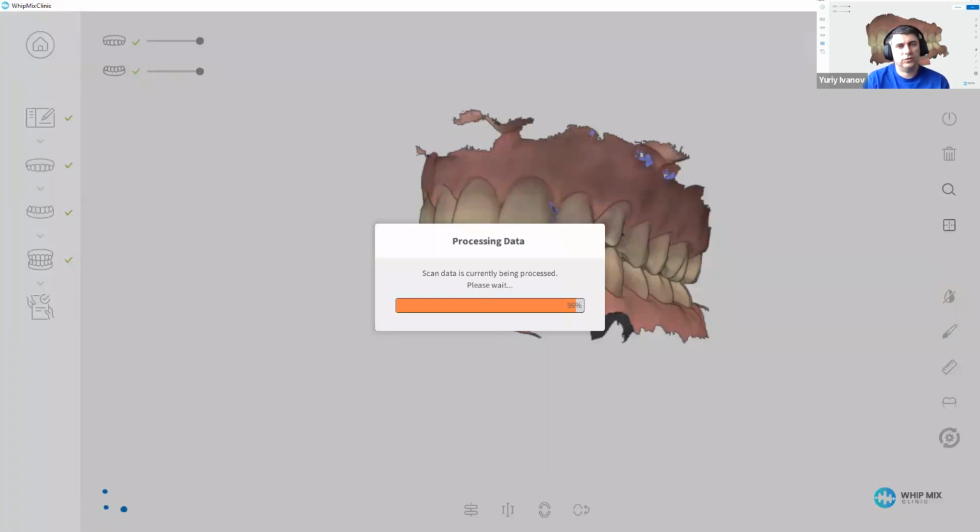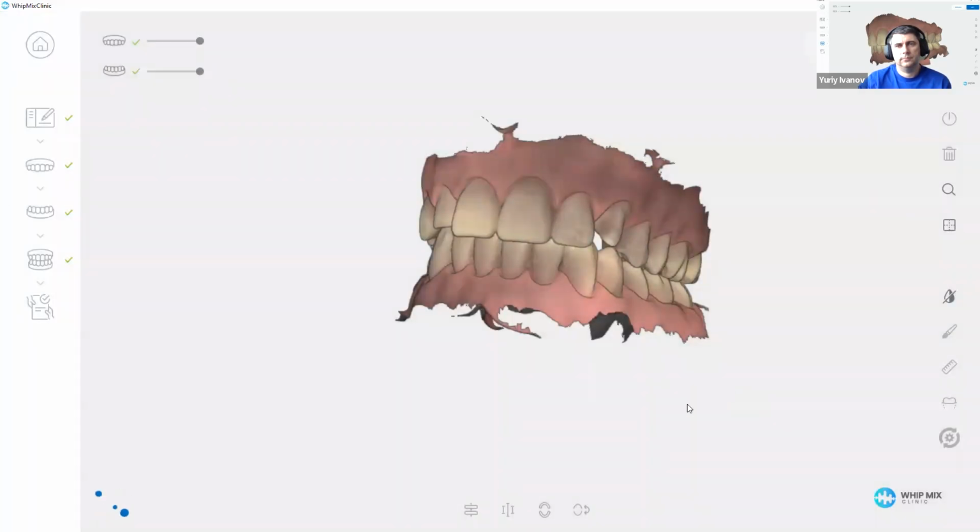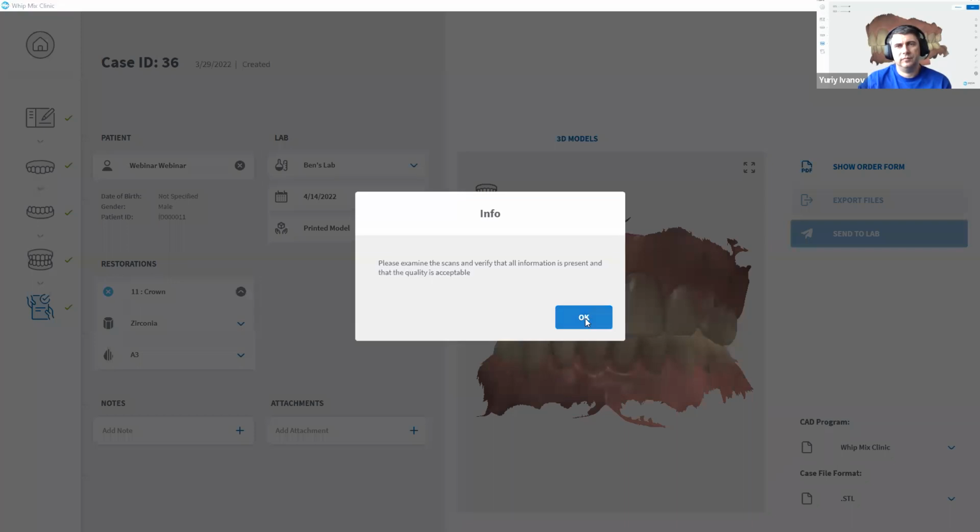Yeah, you could say it's almost done. And we should confirm that yes, we will verify this information.